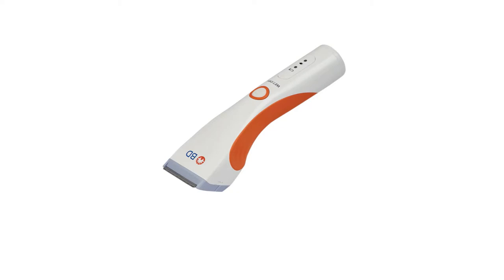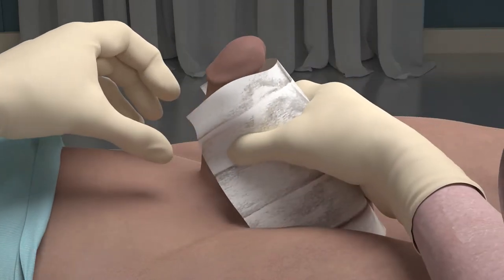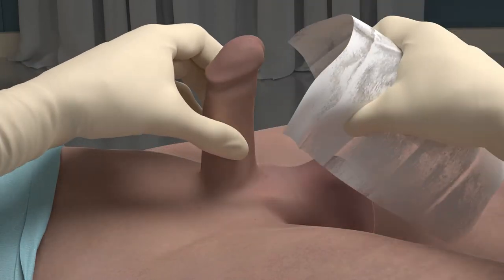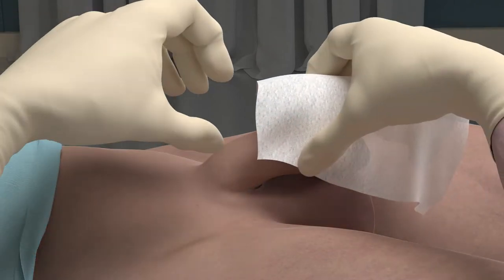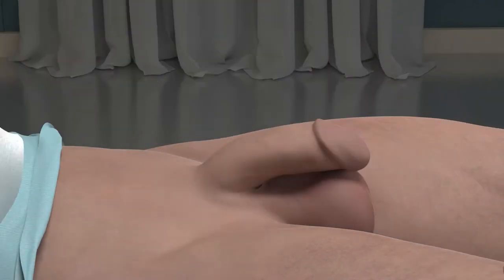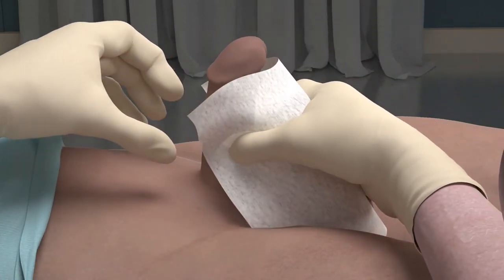If there is significant pubic hair, trim or clip the pubic hair. Perform perineal care using the included wipes and assess skin integrity. Follow and document per hospital protocol. Use the included drying wipe to ensure skin is dry prior to placement, as moisture on the skin will weaken the adhesive.